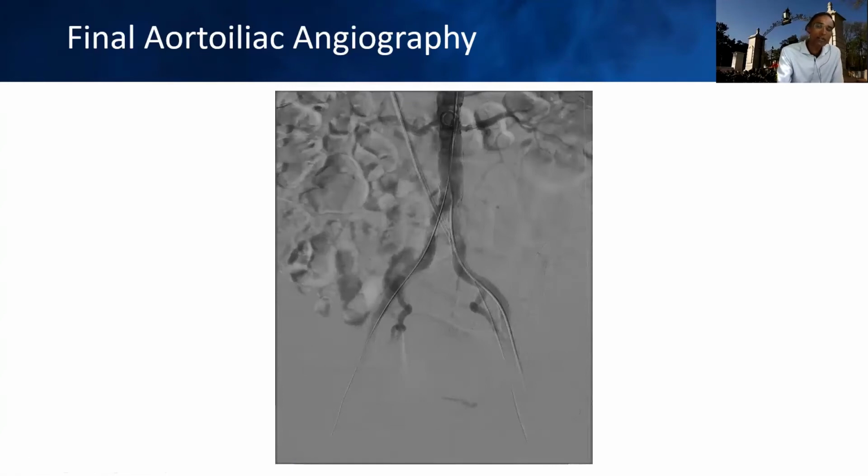Except in the rare instance where we may see a vascular injury. In some of the data that we've collected so far that Dr. McCabe showed earlier, we did see frequent low-grade minimal dissections, and you might see a slight edge tear, but we hardly ever saw anything that required anything more. There were no ruptures, no perforations, and no flow-limiting dissections in our early experience.